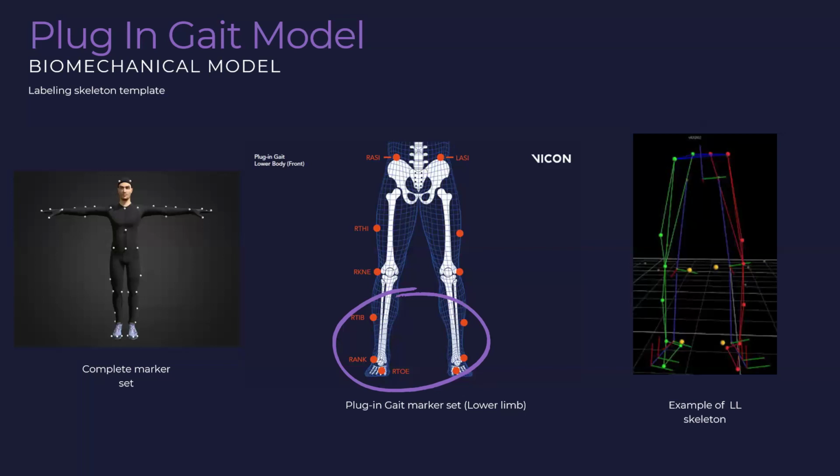Yeah, shorter. Okay. Have you seen anyone connect the EMGs to that system? I'm pretty sure in Boston they were using that. But I've seen that there are some extra analog plugs, so we can do that if necessary. The other good thing about BERTEC is that it's capable of doing incline. So if you want to apply more severity or resistance to the movement, you can check different inclines and see the level of assistance that your exoskeleton is providing.